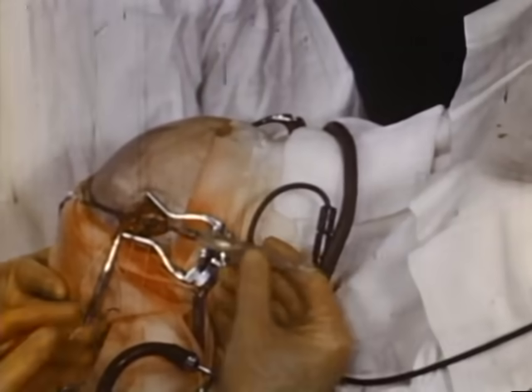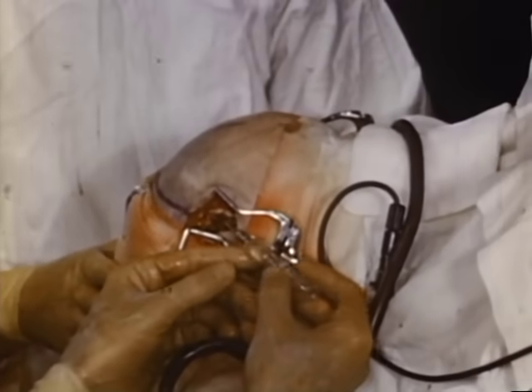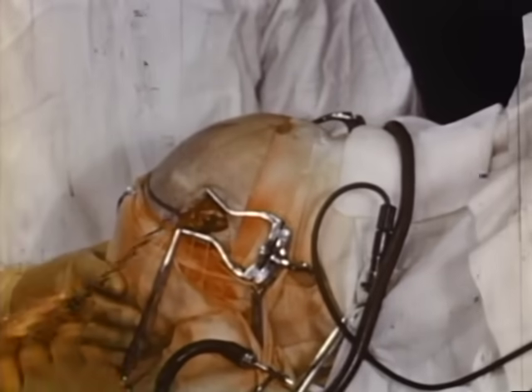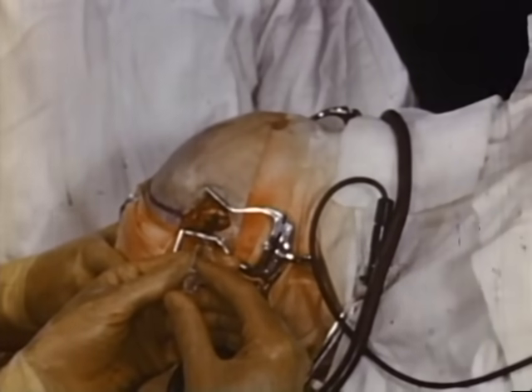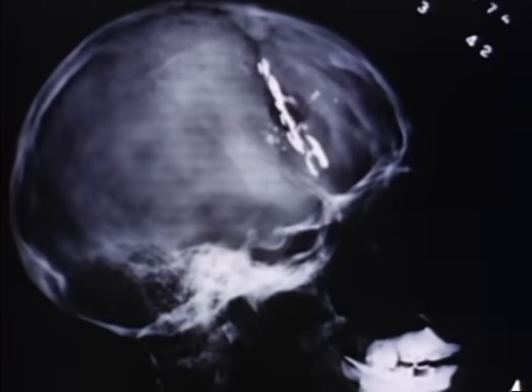When the operation has been completed on both sides, the surgeon injects a few drops of iodized oil into the upper and lower extremities of the incision in order to demonstrate by x-ray their exact location. This is of importance since a failure of the operation can often be correlated with the erroneous placement of the incisions.